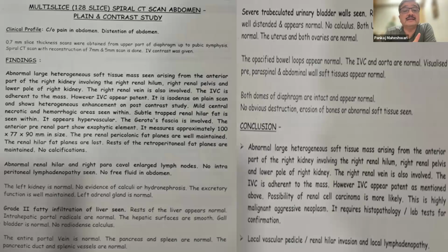Again, here they have said involvement of renal vein. They have not said renal vein thrombus. These are two very different things. When they say renal vein thrombus, the tumor should grow inside the lumen. Nowhere have they shown growth of the lesion inside the lumen.